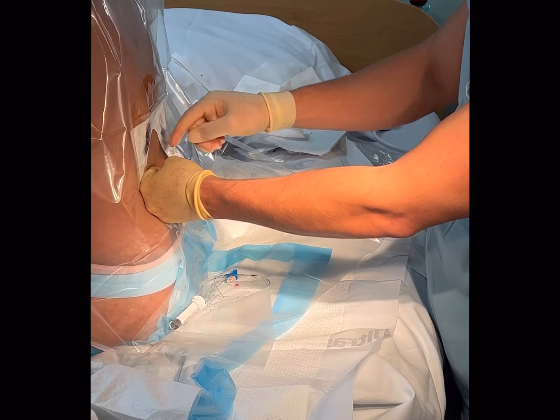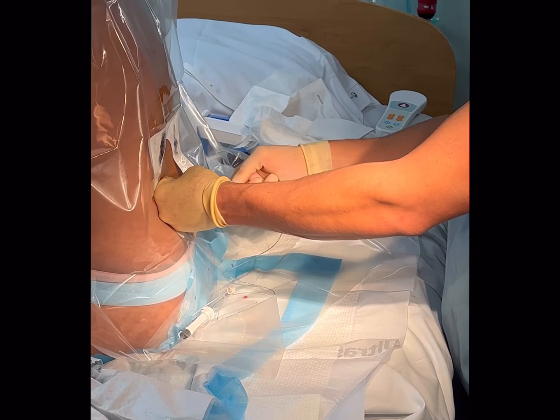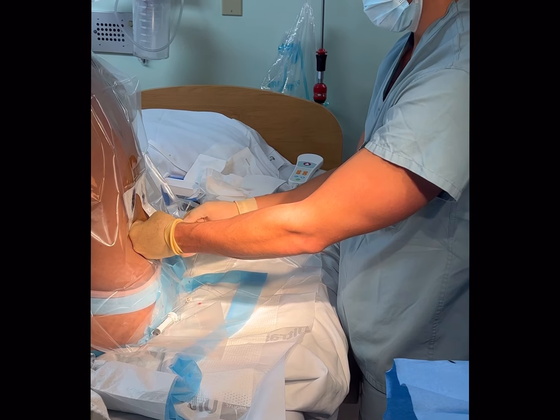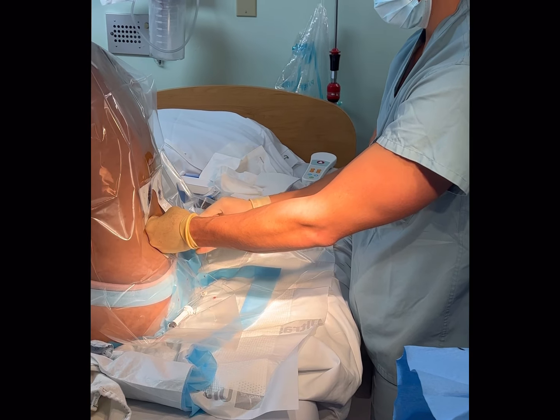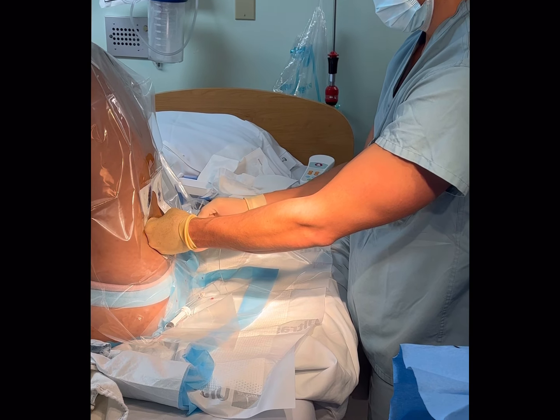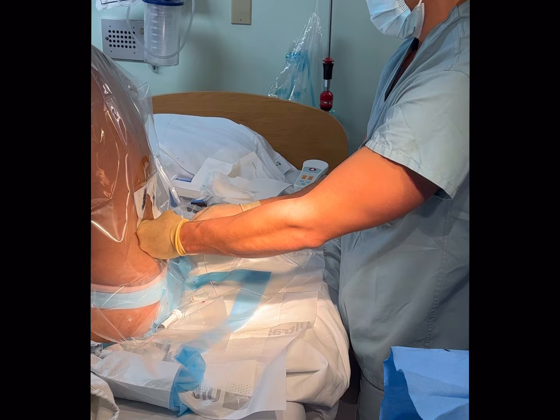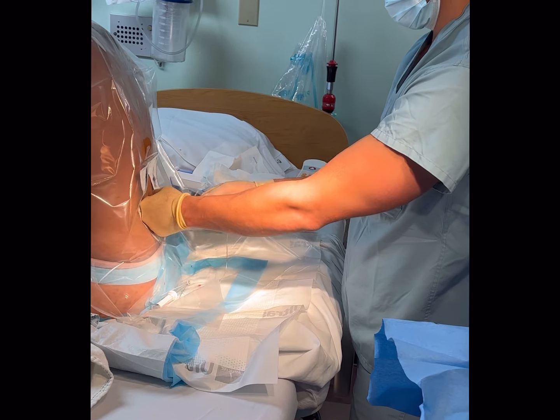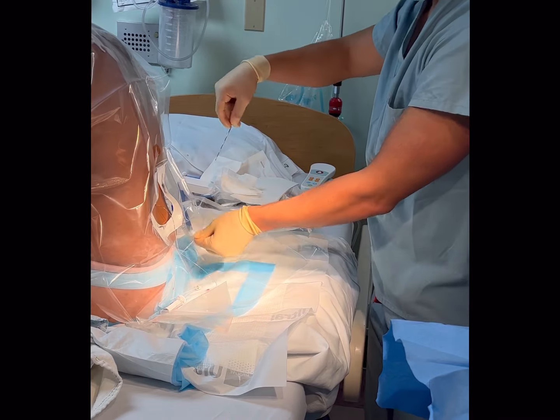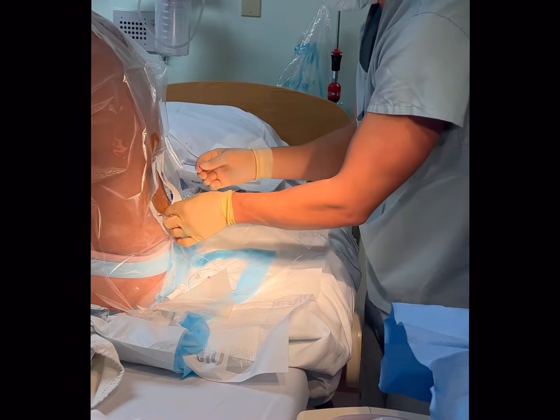I'm counting back — I'm at 5 at the skin with the Tuohy at 28. I'll leave it at about 9, since I like to leave 4 centimeters of catheter inside the epidural space. I'll thread all the way to 20, then 24 — the four-line mark. I'll then bring the needle out, which gives me enough real estate. That's 15... 12... 10... 9. Perfect.